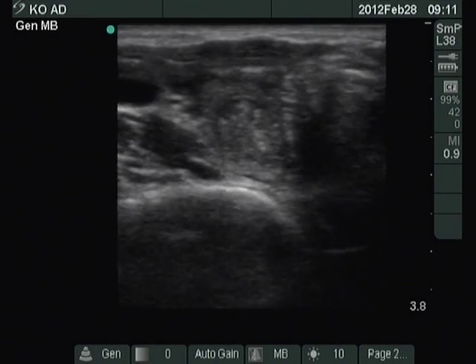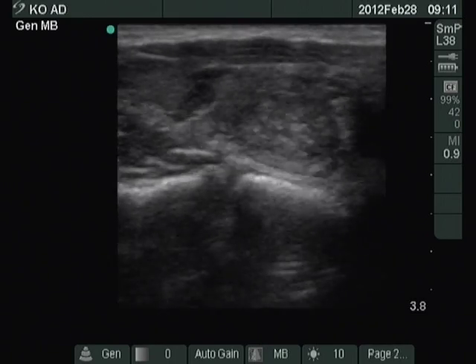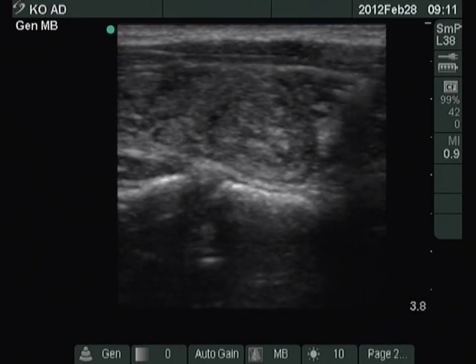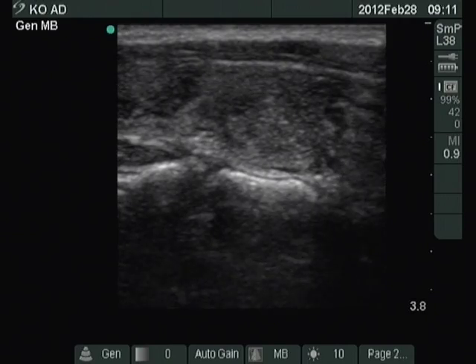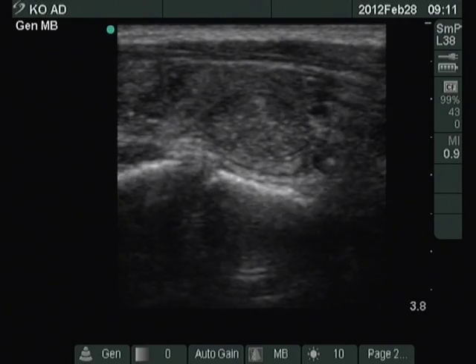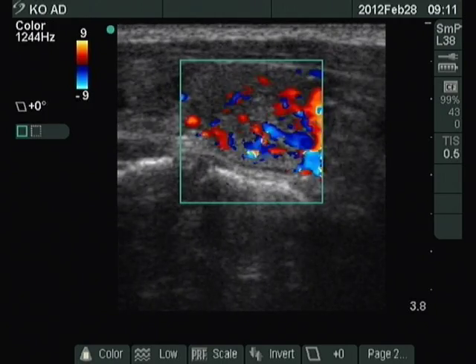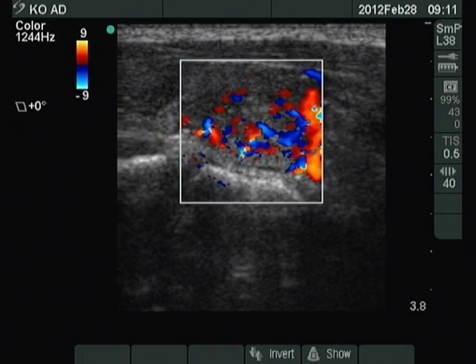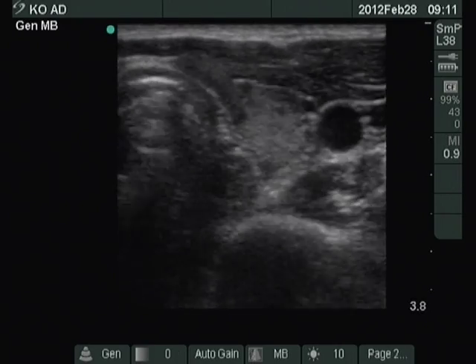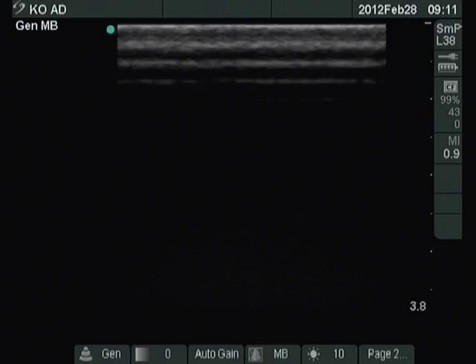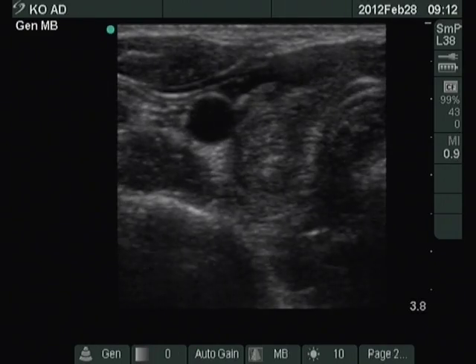Horizontal view of the right thyroid is presented. Note the presence of microcalcifications within the lesion. The vascularization is significantly increased. The left lobe contains small foci of hypoechoic areas.